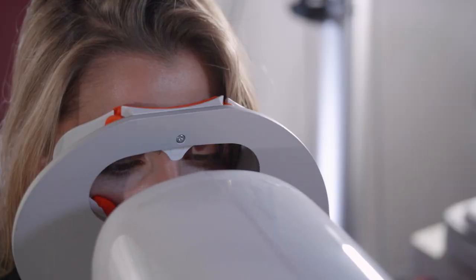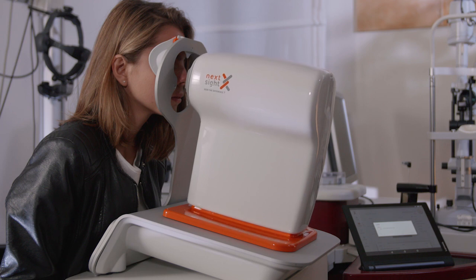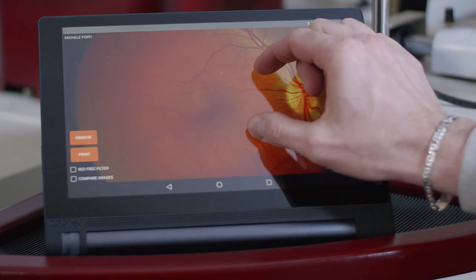Pressing the green button activates the automated examination. The image appears on the tablet after about 15 seconds. A copy of the image is saved at this point to allow more detailed analysis.